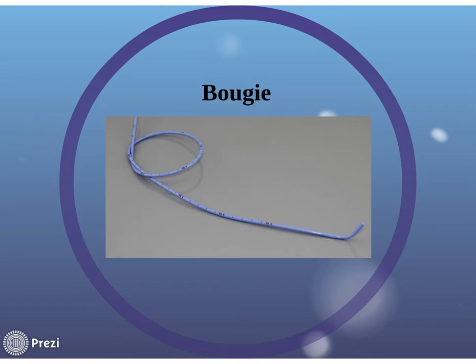That's why this is really helpful, because if you know that the trachea is anterior to the esophagus. If I put it in and it's smooth as glass, it could be in the trachea because maybe I didn't hit the rings, but it might be in the esophagus. So I like this.